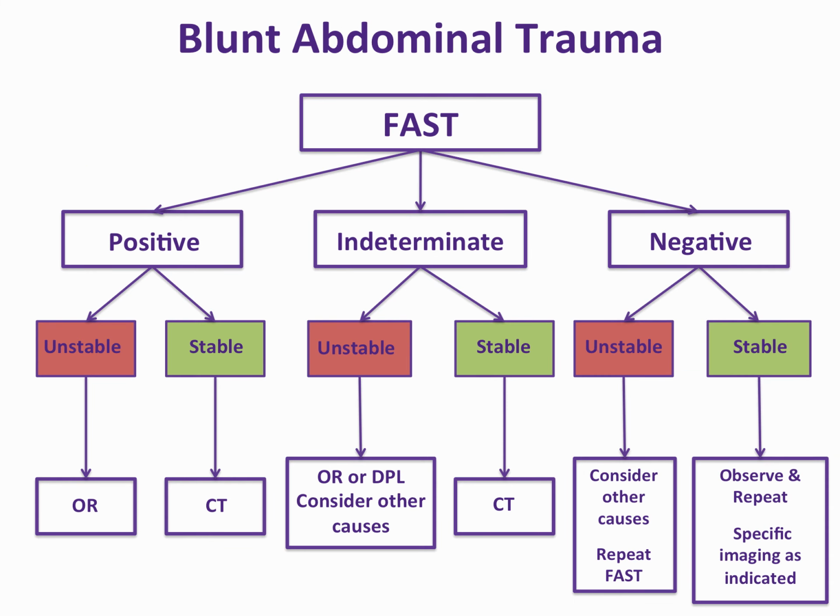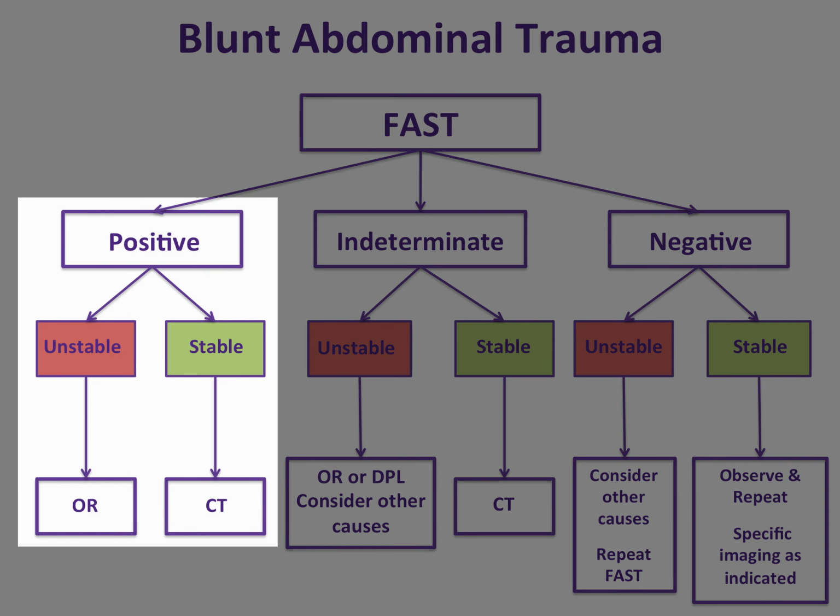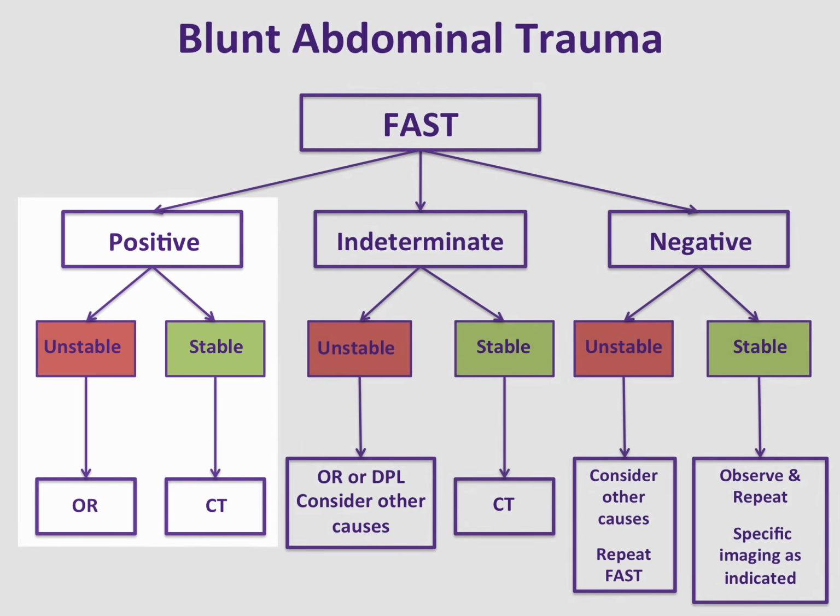The following algorithm provides a framework for the clinical use of point-of-care ultrasound in trauma. As always, there is no replacement for sound clinical judgment. If the scan is positive and the patient is unstable, this is an indication for immediate laparotomy. If the scan is positive and the patient is stable, most patients will go to the CT scanner to better delineate their exact injuries and plan operative management as indicated.